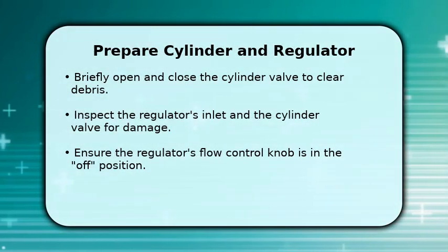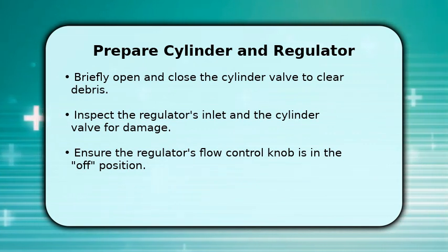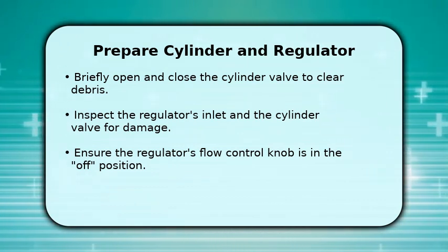Now, let's prepare for connection. Gently crack the cylinder valve by opening it for about 1 second and then closing it. This clears any dust or debris from the outlet. Next, carefully examine the regulator's inlet and the cylinder valve for any nicks or damage. Finally, double-check that the regulator's flow control knob is fully closed or in the off position before attaching it.